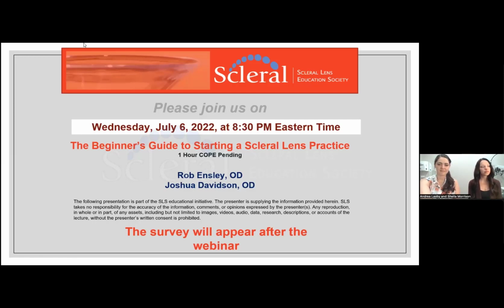Someone asked if higher order aberration lenses are good for correcting vision due to the posterior corneal keratoconic changes. So I guess to see if that's what's pulling through to cause those aberrations. Yeah, I always just measure it, and it doesn't hurt. Yes, it can, absolutely. And that's kind of what it's there for.